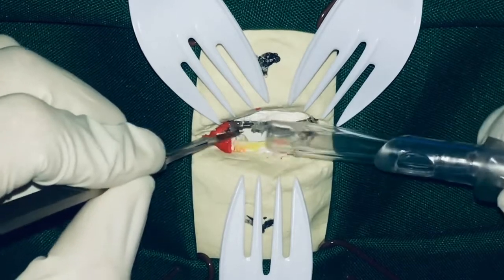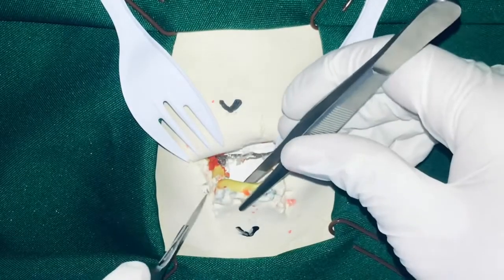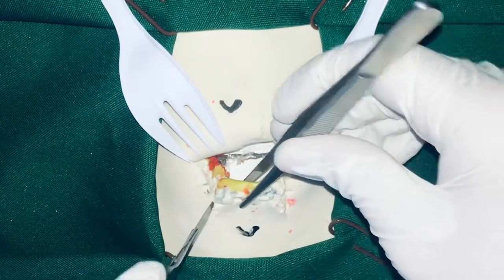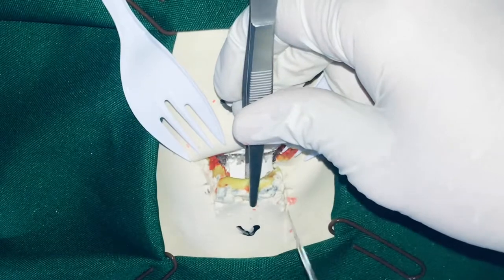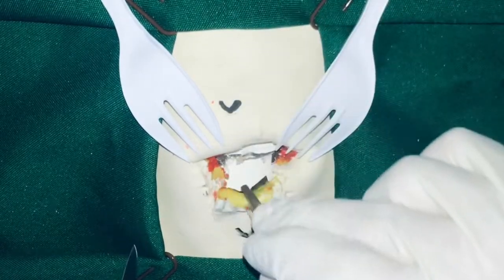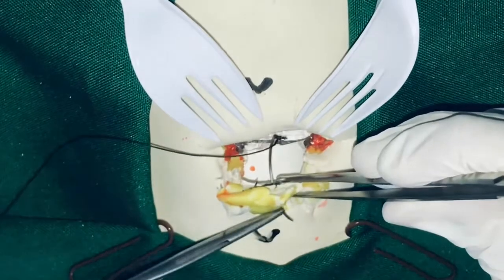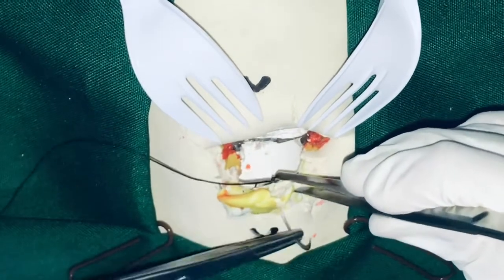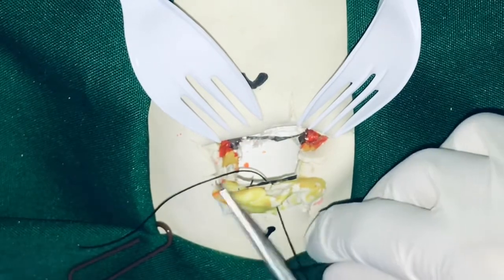Blood is suctioned away for better visualization. A Bjork flap is made to help with tracheostomy tube changes. This is done by cutting the third and fourth tracheal rings to create a big flap. This is sutured with a chromic stitch to the skin. To safely secure the stitch, make sure that you're suturing from underneath the cartilaginous tracheal ring.